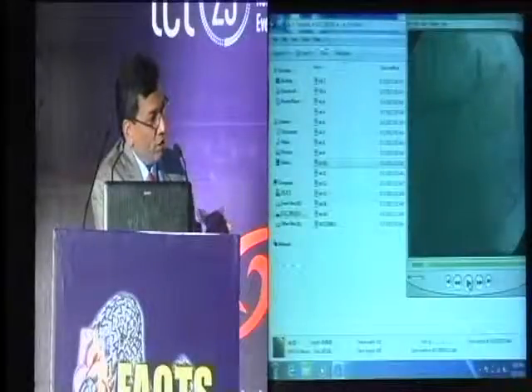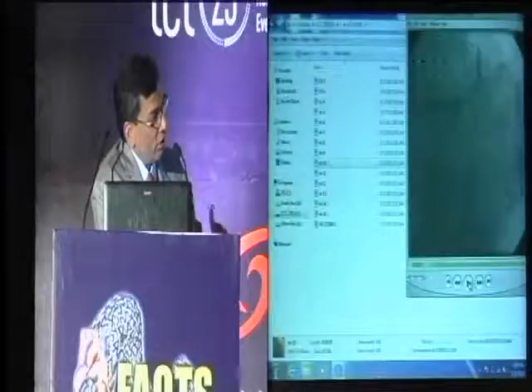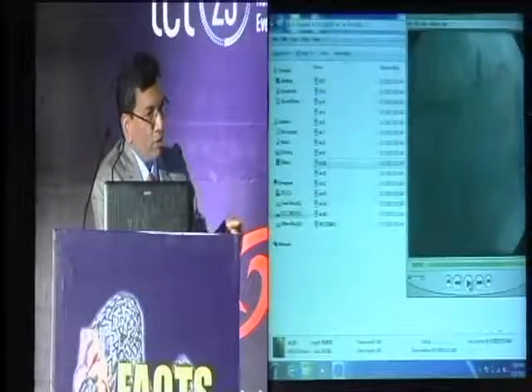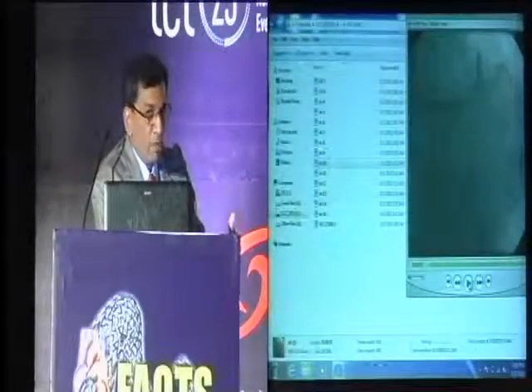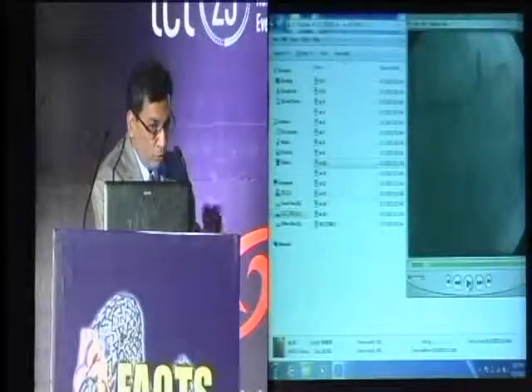The technique I used is a balloon butting technique: have the stent go past the bifurcation, parked in the diagonal, inflate a balloon in the LAD, and then pull the stent to butt against the balloon and deploy it.